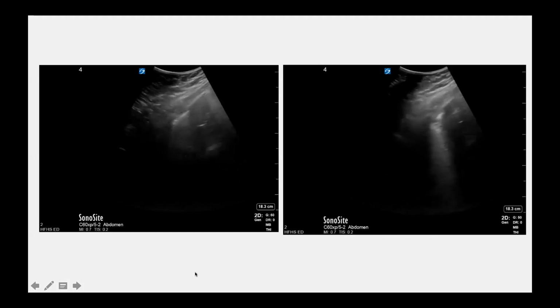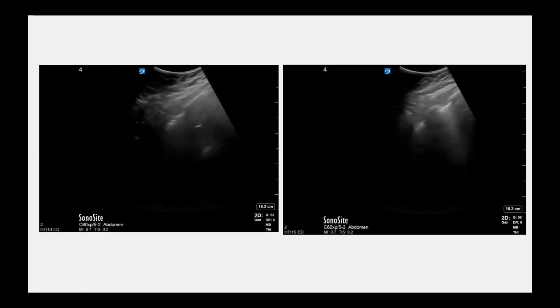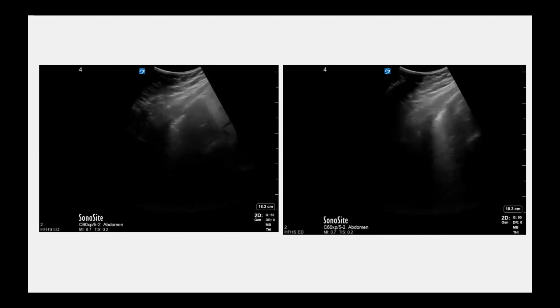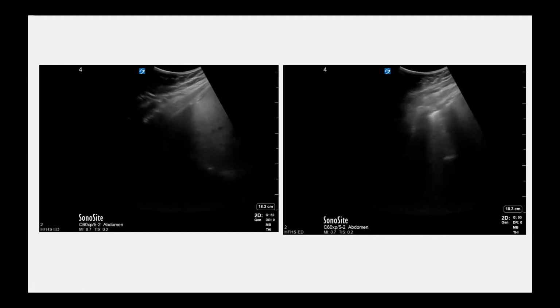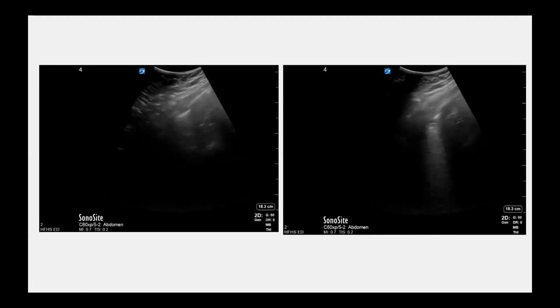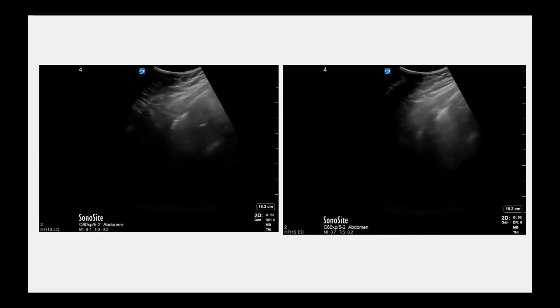And just to clarify, when you see a pleural line like this, this is where you have to use your scanning technique to try and clean it up or improve it. So you want to make sure that you are fanning the probe to try and get it perpendicular to the pleural line to get your cleanest line. Remember, the chest is basically a barrel shape, and so sometimes that requires fanning the probe to clean up that pleural line to make it better. But in this case, these images were recorded with the best pleural line we could get.